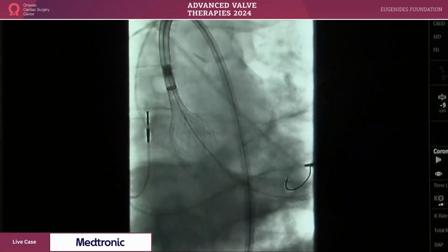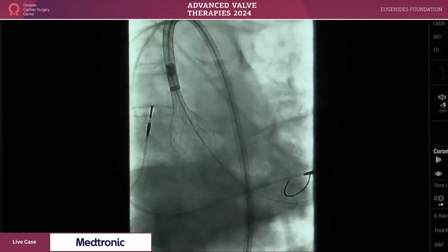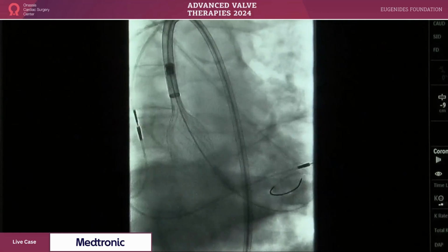No, it's popped. Okay, so we need to stop here and then just place some dye. You're already up again. I think it seems that it's already up. Yes, it is.